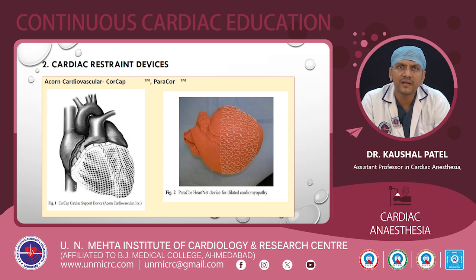These devices are applied outside of the LV and RV, so they can decrease ischemic LV dilatation, which decreases the MR by limiting LV remodeling. So it can maintain the same level of mitral regurgitation as previously present.